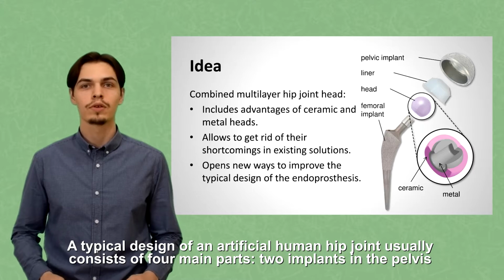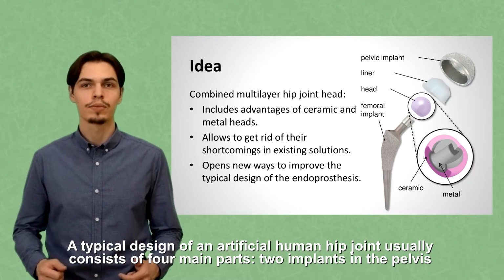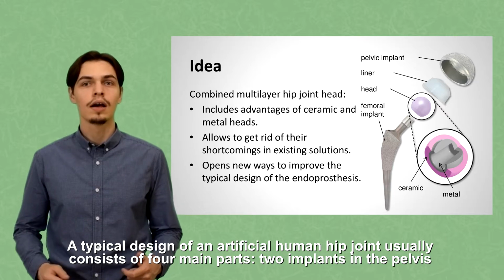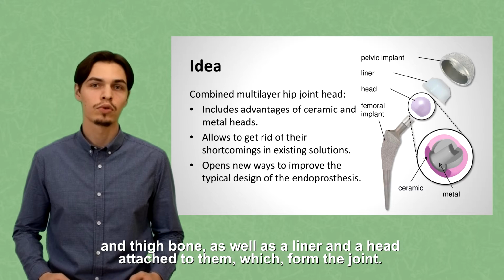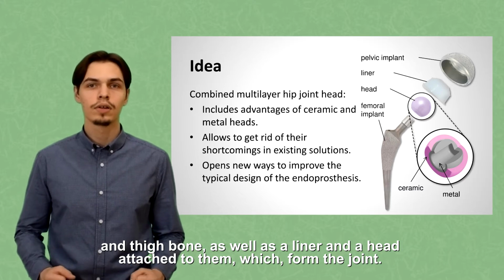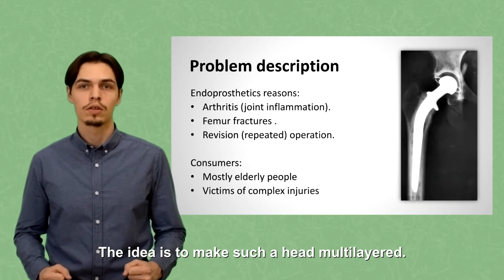A typical design of an artificial human hip joint usually consists of four main parts: two implants in the pelvis and thigh bone, as well as a liner and a head attached to them, which form the joint. The idea is to make such a head multilayered.